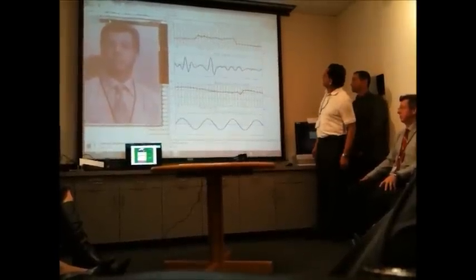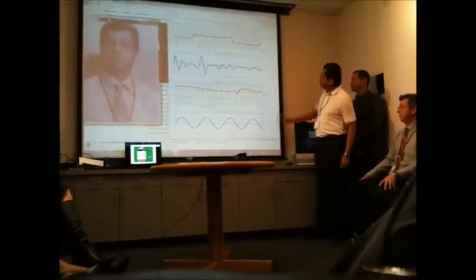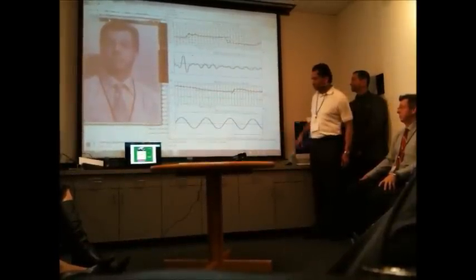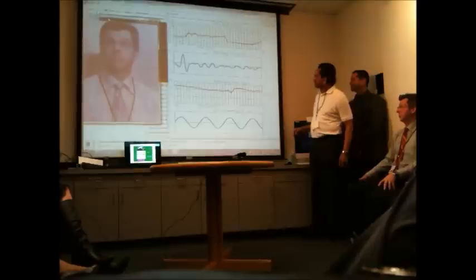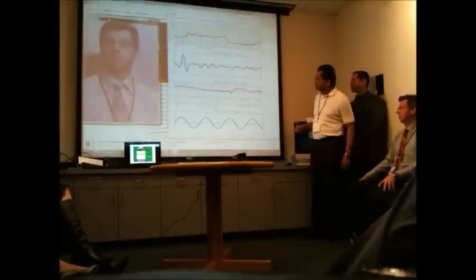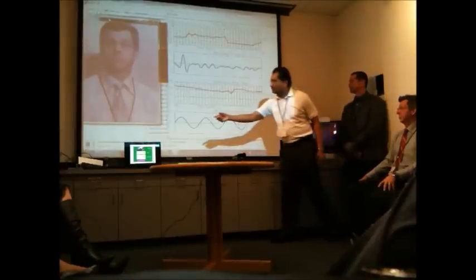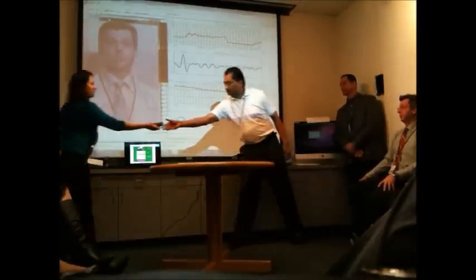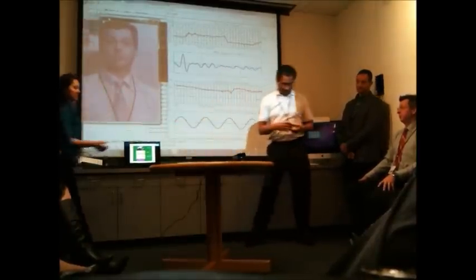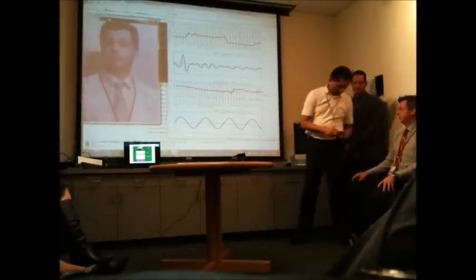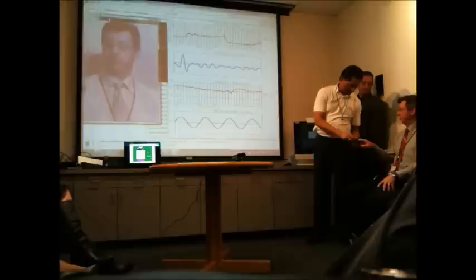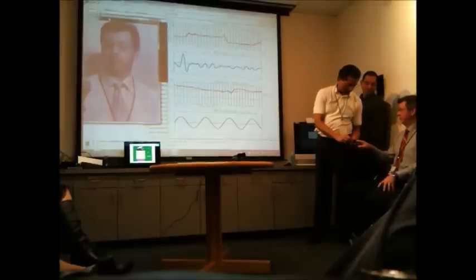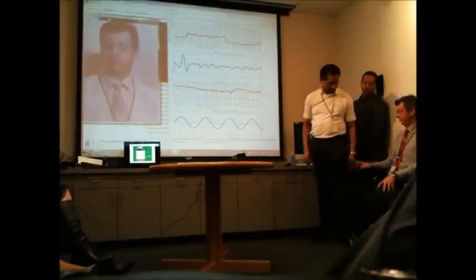Here we have a respiration rate of 22 cycles per minute. We don't have a ground truth to compare against at the moment, but we can show the pulse rate — though it takes some time before the numbers stabilize and become accurate.